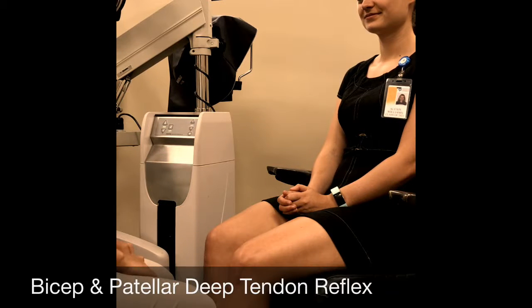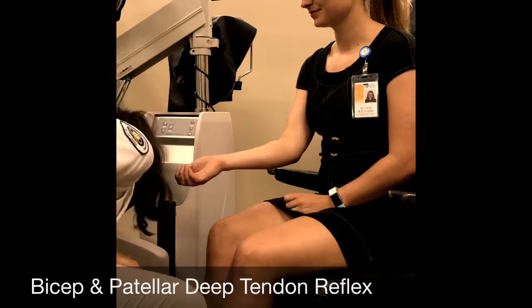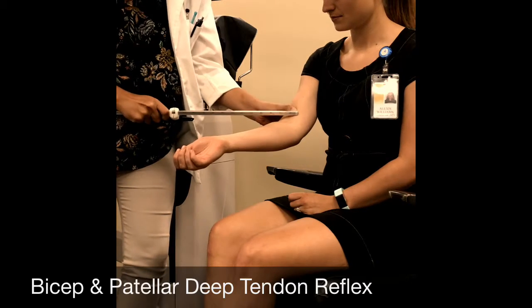Okay, we're going to start off with the biceps and the patellar deep tendon reflexes. To begin on the biceps, you start by putting a hand on the biceps tendon, and then you will strike the thumb with your instrument. You will feel and see the muscle contract. This is a very slight reflex.